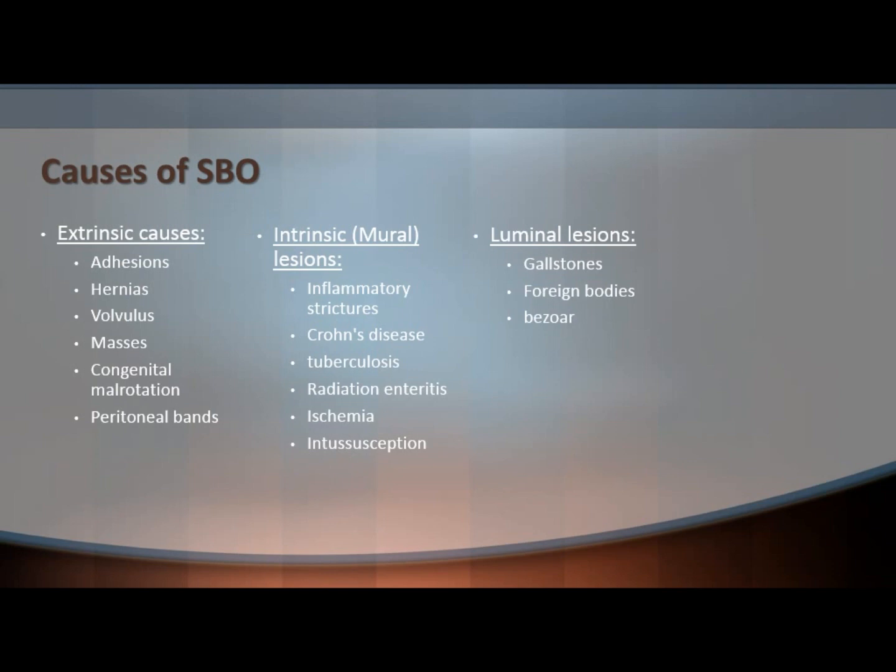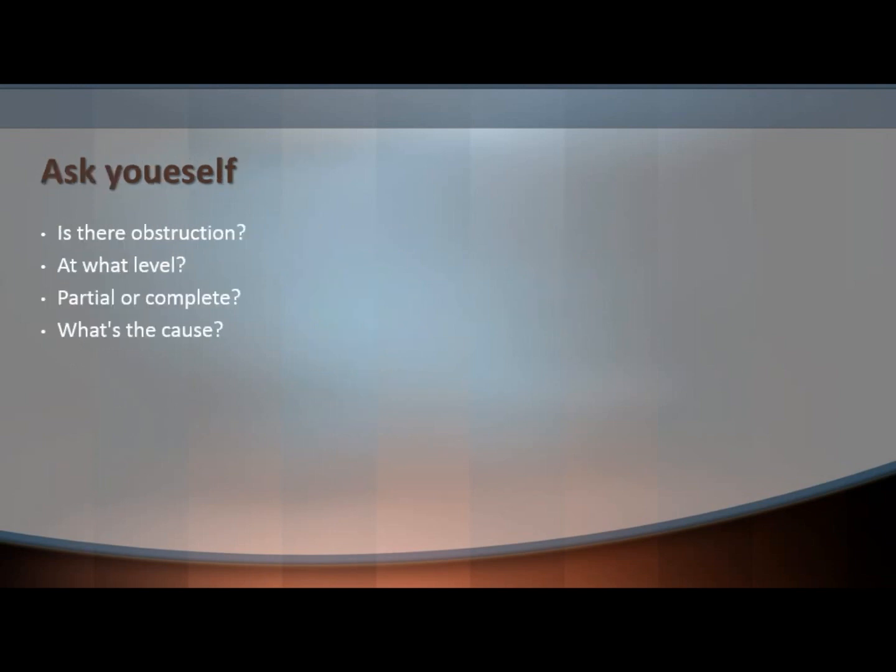The luminal lesions, the lumen is obstructed. It's a mechanical obstruction. So we may have a gallstone impacted in the lumen, causing gallstone ileus. We may have foreign bodies like bezoars, or sometimes tablets may cause obstruction. Parasites, yeah.